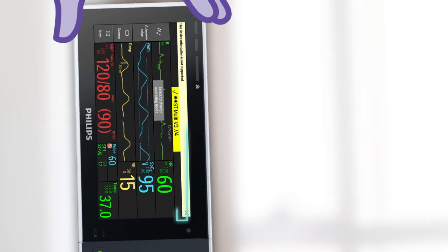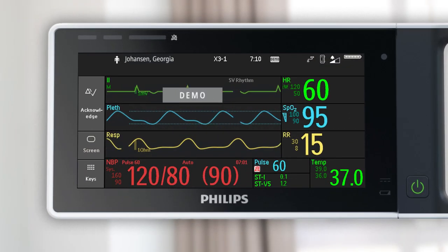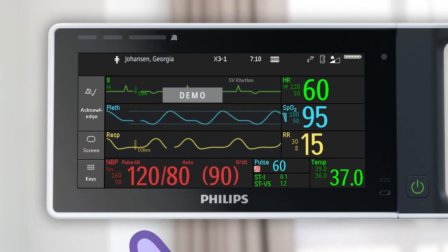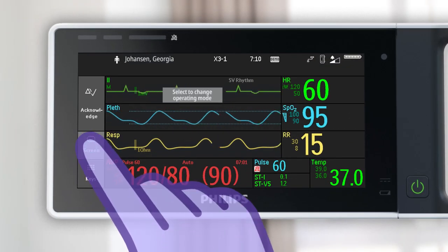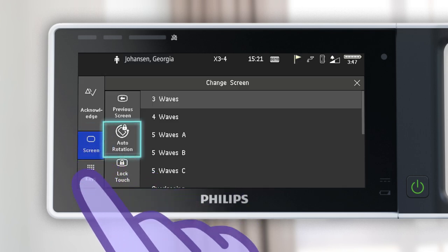To turn autorotation on or off, touch the screen permanent key, then touch auto rotation.